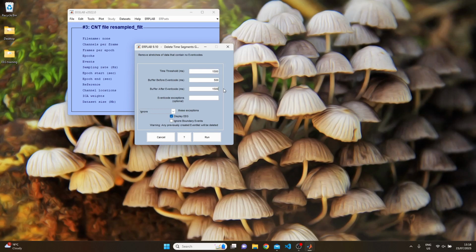Decide your after buffer period based on how long you want your epoch data segments to be, if that's the case. The event code exceptions you should only use if you've got triggers that you don't want EEGLAB to consider when it's looking for these periods of time without a trigger. So if for whatever reason I have a trigger 33 in my dataset and I'm not actually interested in that, it's just a break trigger or something, then I'll want to pop that into the box and make sure that it's set to ignore these exceptions. And that means if it finds a 33, it won't count it as a trigger and it will continue to delete through that segment of data.